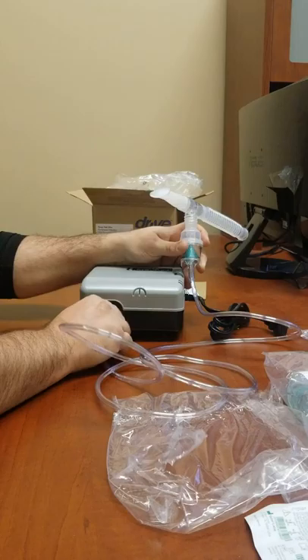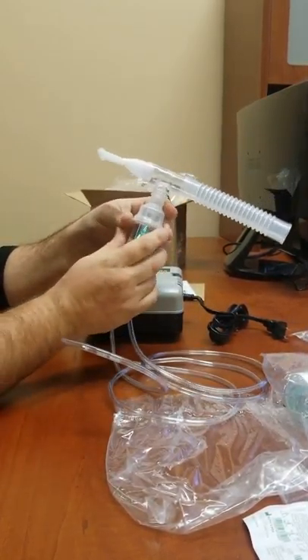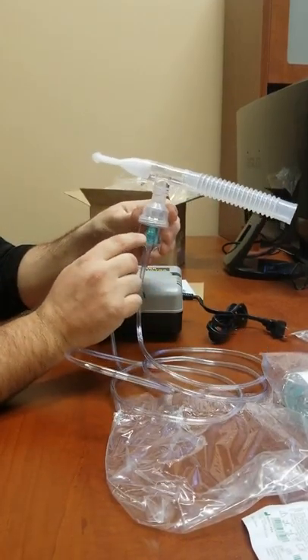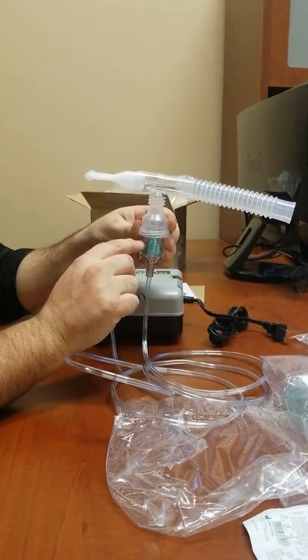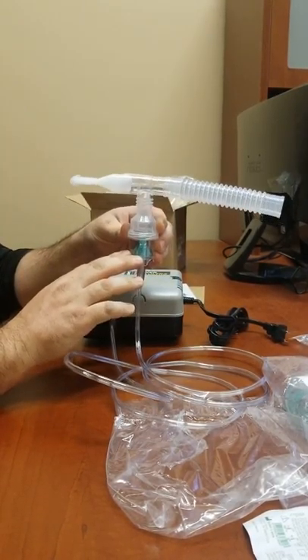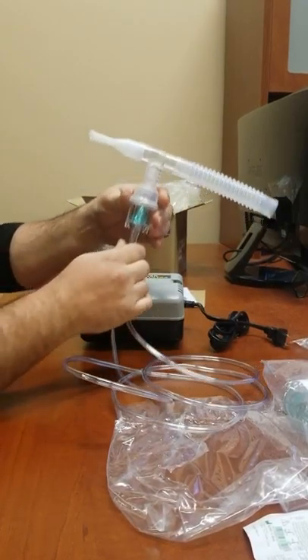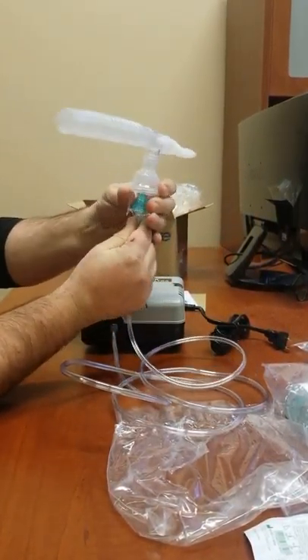Just slide that on and turn your machine on. Once you fill it up with your medication, you'll want to make sure it's completely empty before you shut it off. Once you do shut it off, you can undo your tubing from the bottom by just spinning it.